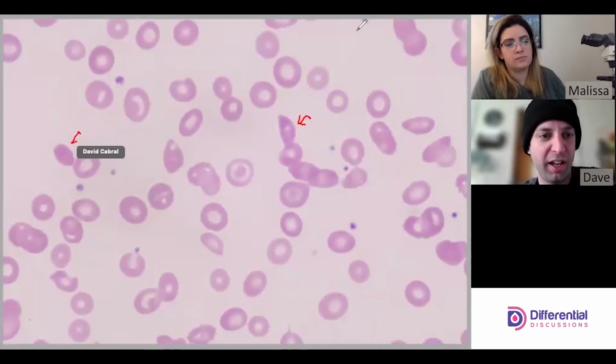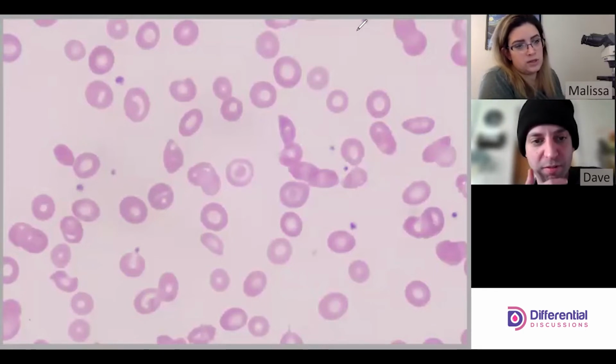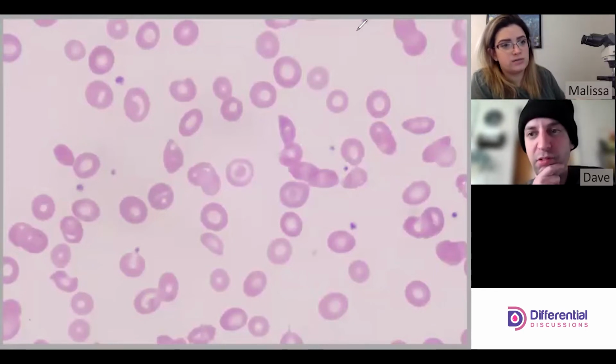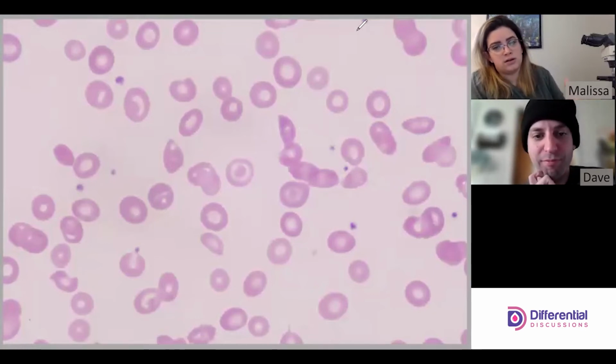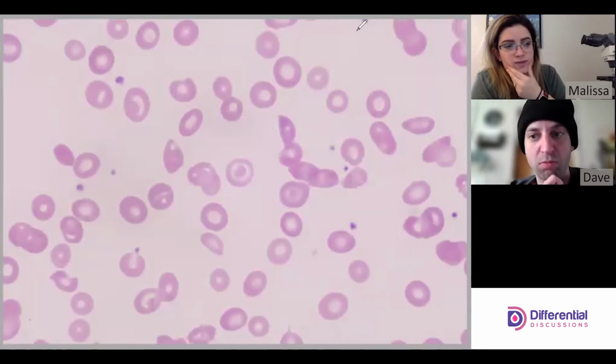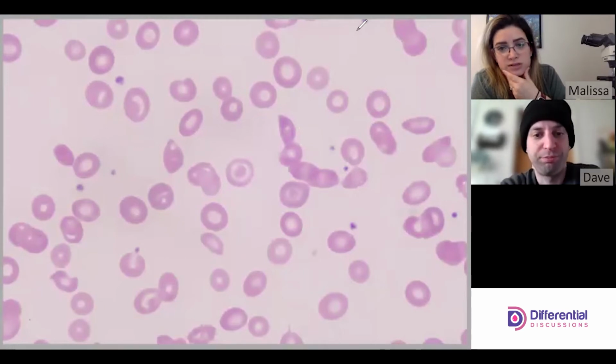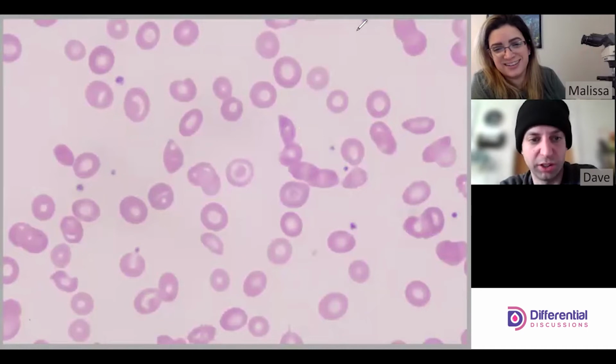But I'm noting that deep red. Yep. It's that concentrated hemoglobin. You said earlier, dehydrated, right? So it's that nice color. It's typically a little bit darker than spherocytes, unless they're microspherocytes, and then they have a similar coloration. But this is generally a deeper color than what you see in just regular spherocytes. So mostly sickle cells and codocytes. Codocytes, yeah.